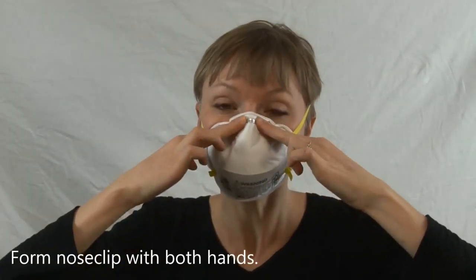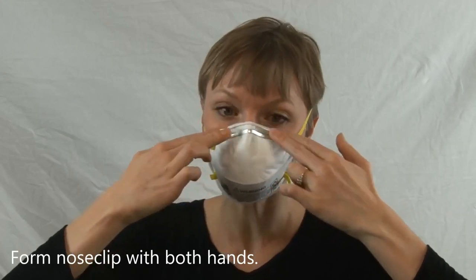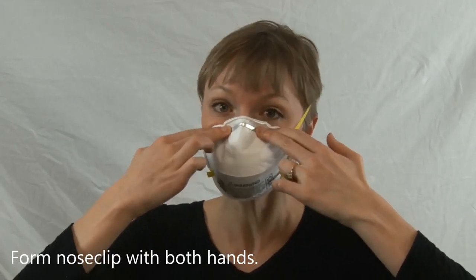You need to have a seal around your nose, so form the nose clip firmly to your nose with both hands. Do not use one hand and do not pinch.